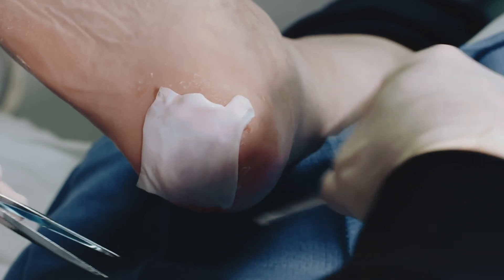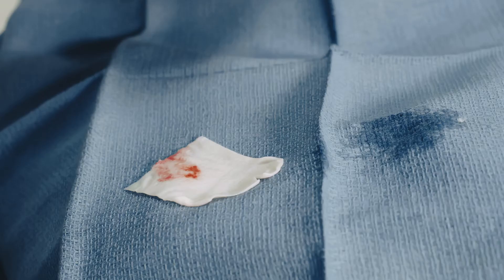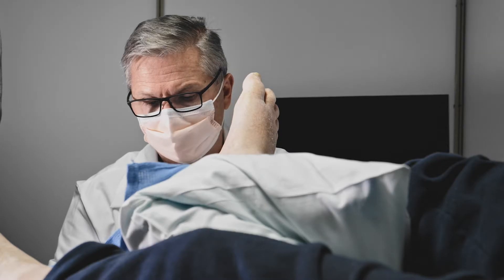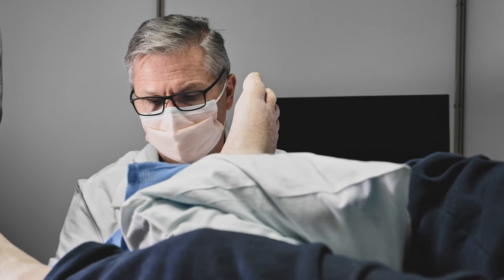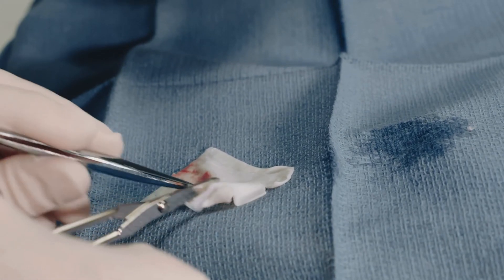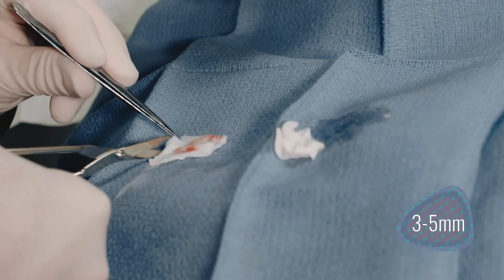The graft can be temporarily applied to the wound to check sizing. The blood patch on the dermal surface will assist trimming of the graft to the correct size. I'll make this a little larger than the blood would show me, because I want to make sure I have full coverage, and then I can alter that once it's on the wound if need be.